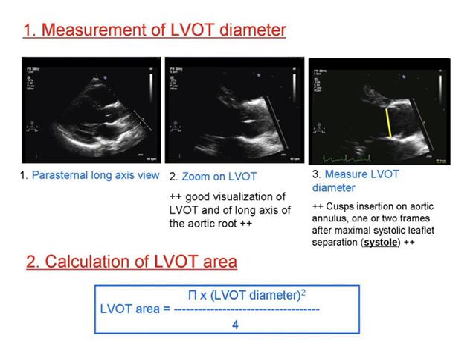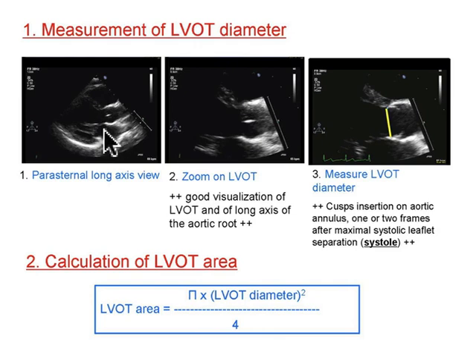To measure cardiac output, the first thing you do is measure the diameter of the left ventricular outflow tract. You can see that in the parasternal long axis. So the first thing you do is go back to parasternal long. That's the RV up here, the LV over here, the LA is here, the mitral valve is right here. The blood comes into the LV and gets pumped out through the aortic outflow tract.